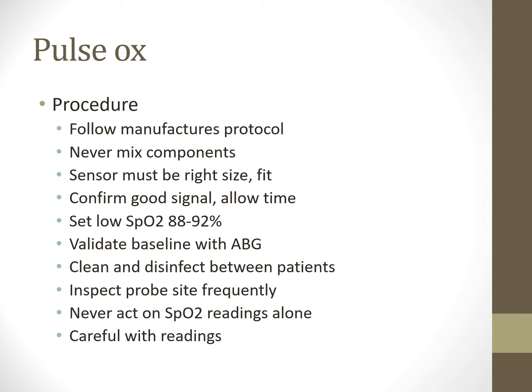Right, never act on saturation readings alone. Remember, your saturation readings are poor. What's the first thing you do? You look at your patient, and then work your way back from there. So always look at your patient first. Never treat a pulse ox signal without looking at your patient and treating them. If they're talking to you and they're just waving at a friend over there, that's probably why their signal's bad.